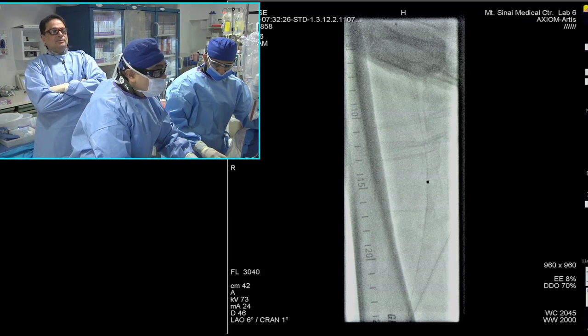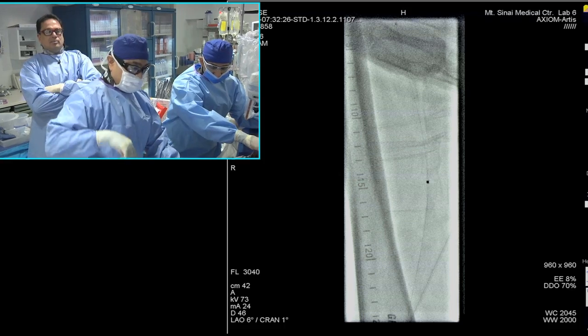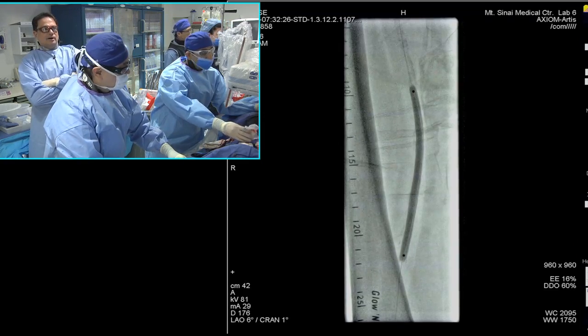The second thing is to avoid the geographic miss. So I hope Sachin and Ray, because I know they're both good operators, know where that balloon landed, because I've been talking to you guys. I can tell you, see that picture right there? That picture is very important.